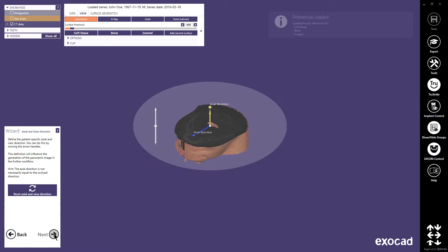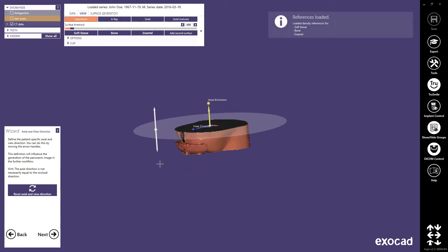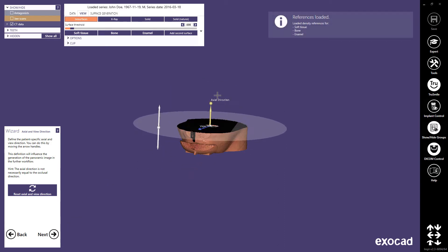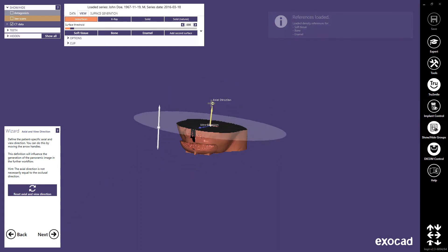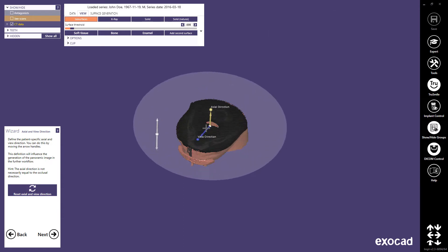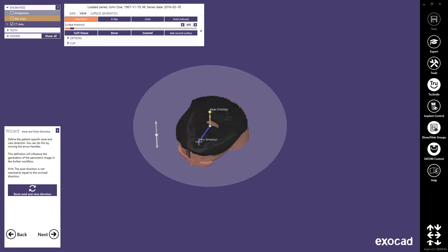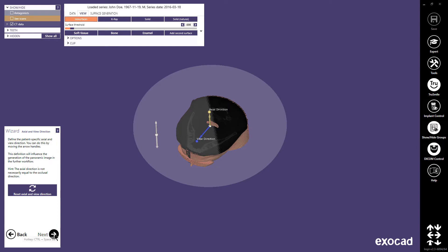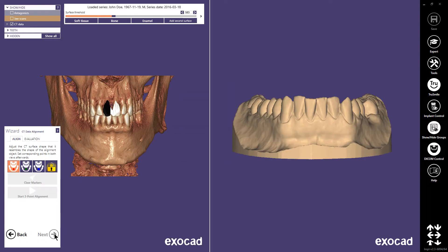Continue with Next. In the next workflow step, you can change the axial and view direction of the patient. This is in most cases not necessary. Continue with Next.